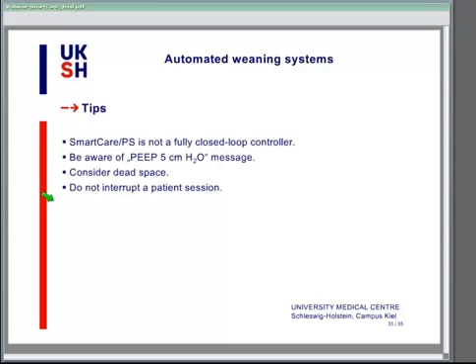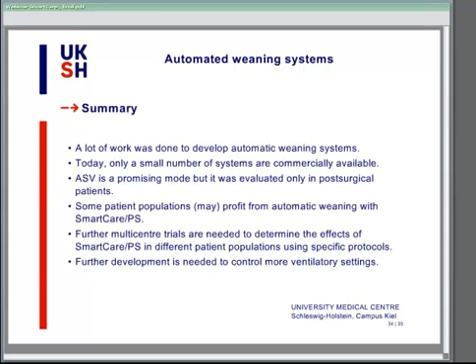The last thing is do not interrupt a patient session whenever possible. The system gets a feeling for your patient, and some of the diagnoses and also some of the time rules implemented in the system depend on the time the patient is weaned with the SmartCare system. So it might be of benefit for your patients if you try not to interrupt patient sessions.